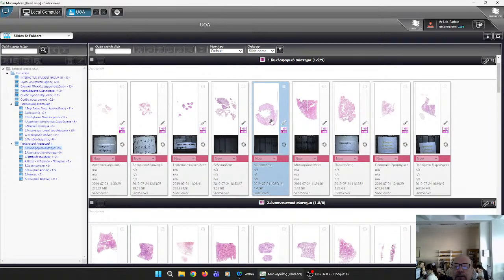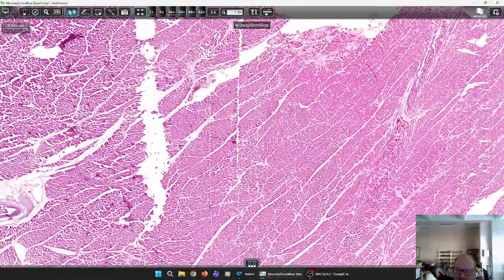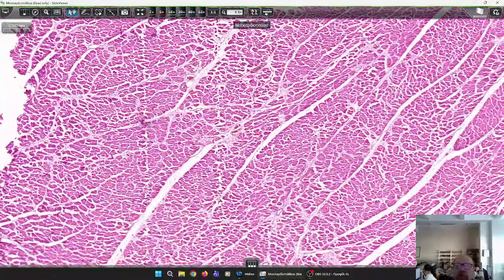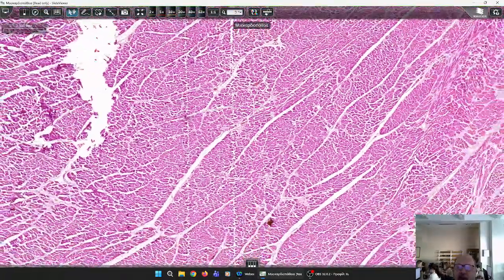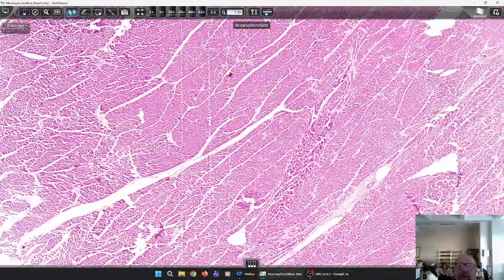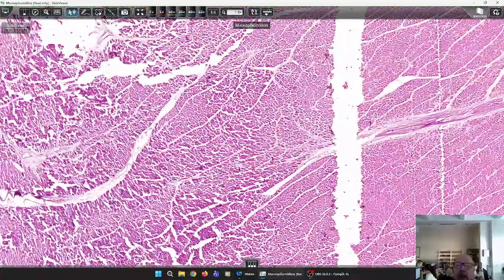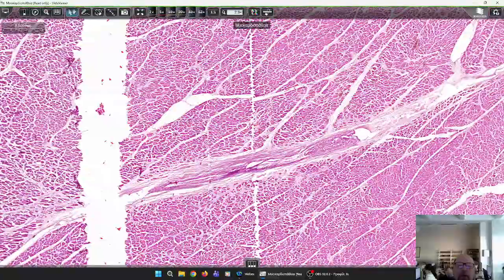So that was the myocarditis, and here we have the myocardiopathy, which is of the hypertrophic type, and the weight of the heart is significantly increased. And what we can see from a histologic point of view is some sort of disorganization in the array of the myocardium fibers. You see that they are somehow not so well orientated, and perhaps some areas of fibrosis as well.